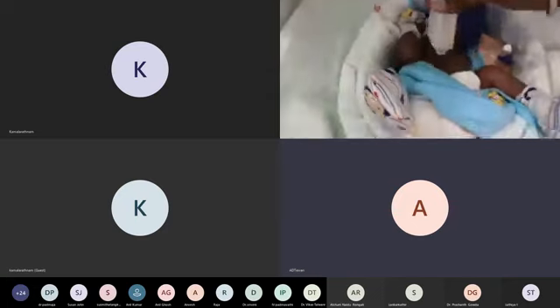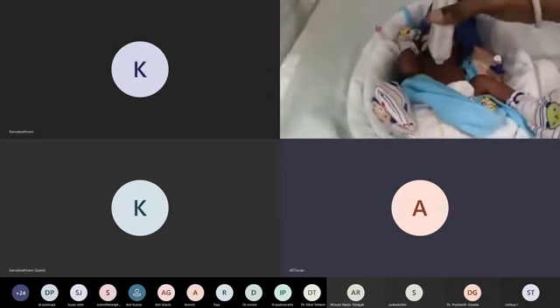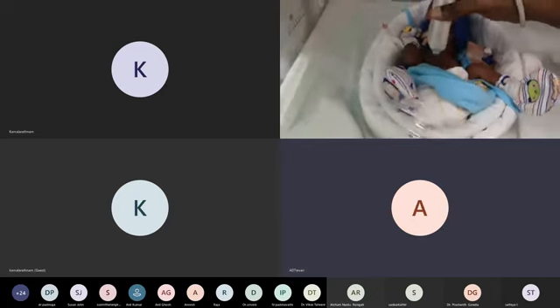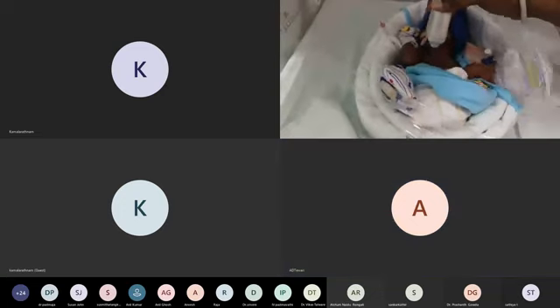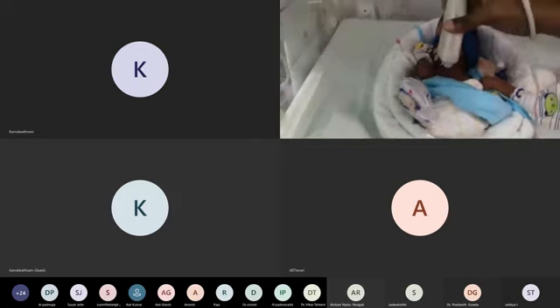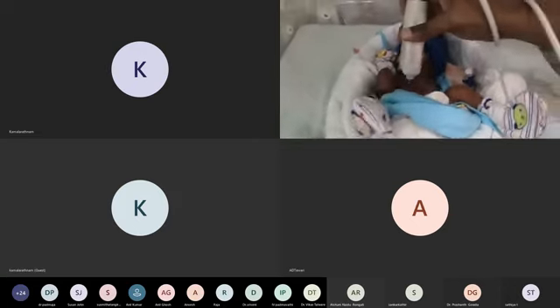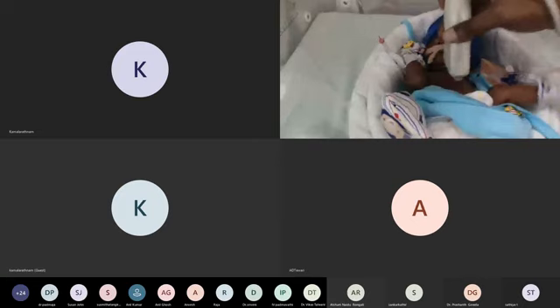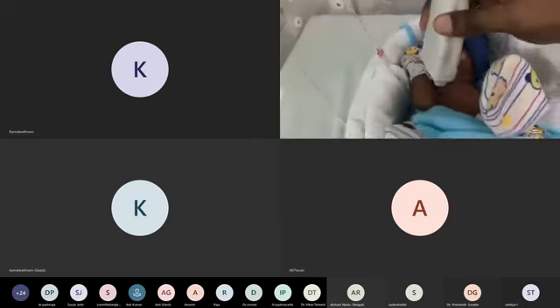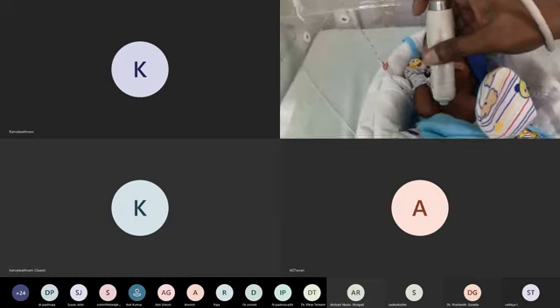So, number 1, I am trying to keep the probe on the chest. I know that the gel is very cold. The baby might cry. If you don't have a gel warmer, try it. In case you have it, buy it, because it is only 30,000 rupees or 15,000 rupees. Ask your boss to get it. See that it should work continuously, otherwise somebody will jack it.